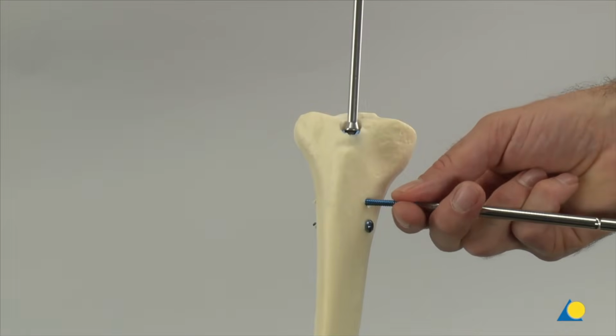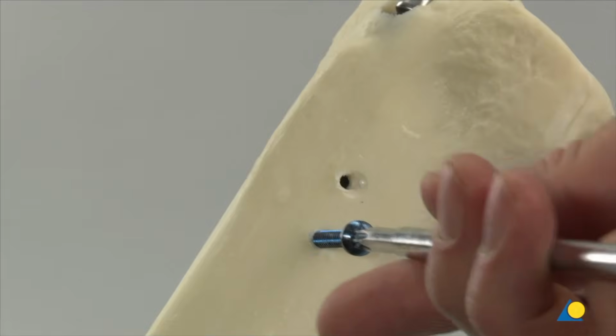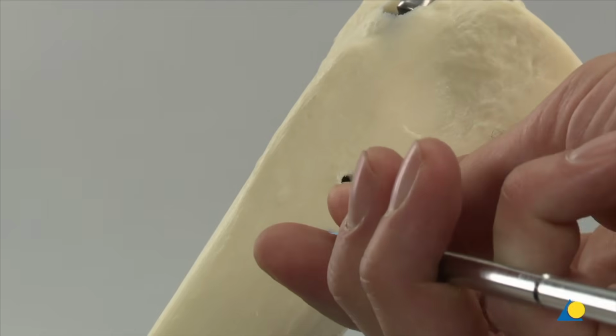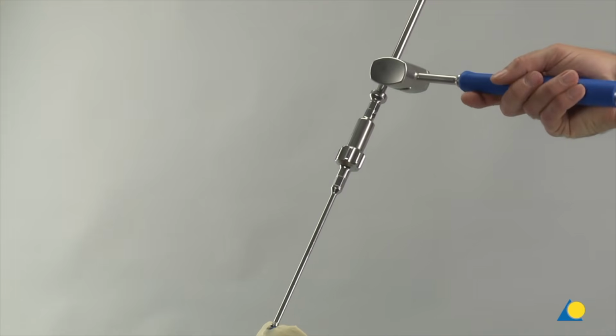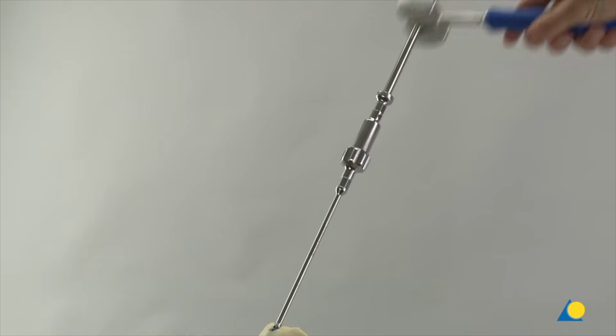The T25 star drive screwdriver is used to remove the locking screws. The combined hammer is attached to the hammer guide, and the nail is extracted with gentle blows using the back slap technique.